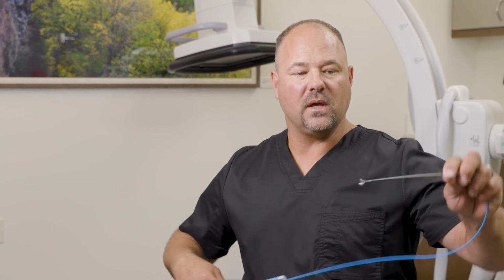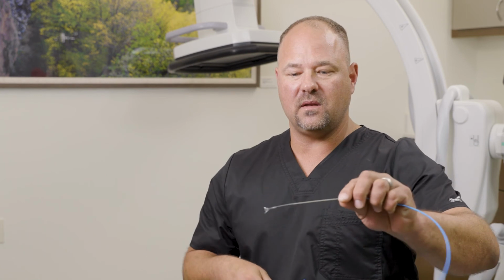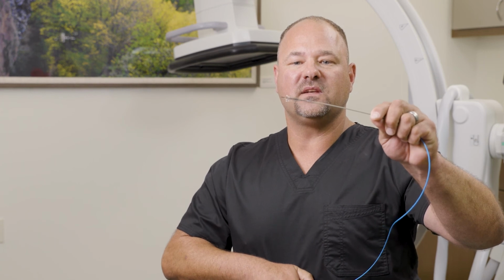One of the things about stents is kind of neat. We have stents that are going into the body just like this, kind of like that balloon I showed you. And then once we get it in the body, we slowly deploy it perfectly in the body. And the neat thing is it expands. So once the stent gets in there, it expands. It goes in really tiny, and it basically pushes that plaque or that blockage behind the stent so that the artery can stay open.